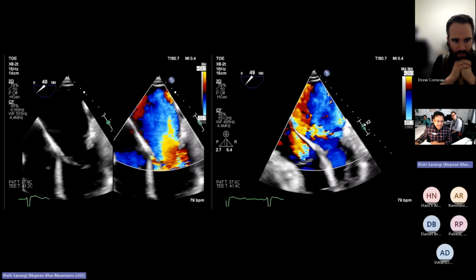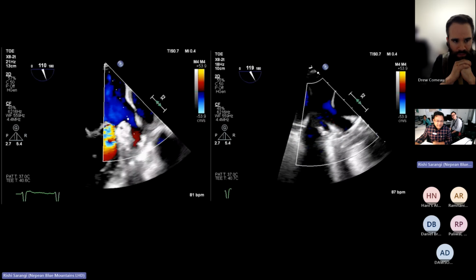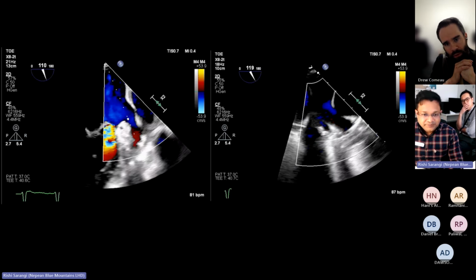Okay. So do we have a mechanism? Looking at pulmonary veins, which pulmonary veins are we looking at? On the left is the left atrial appendage. On the right is the left upper pulmonary vein. That's correct. So initially when we used the classic rule, we got the left atrial appendage. That's why I was telling others not to get sticky about 110, you can rotate a bit further and then you can get the true flow in. The trouser-like appearance, an inverted Y-like appearance, you can get, that'll be great.